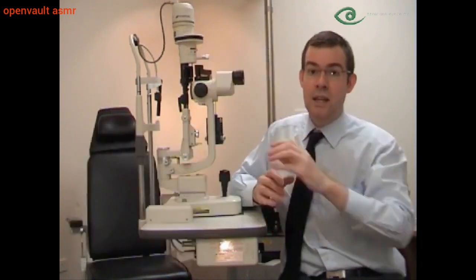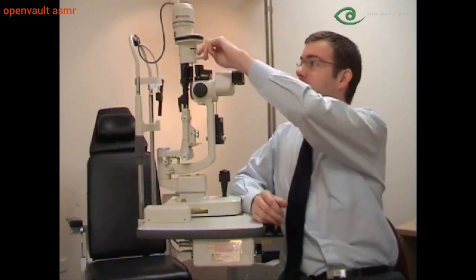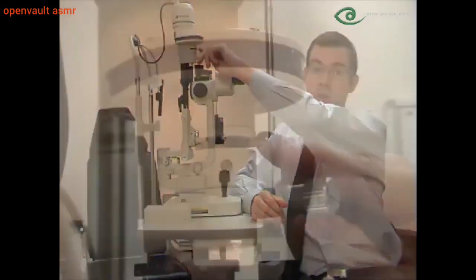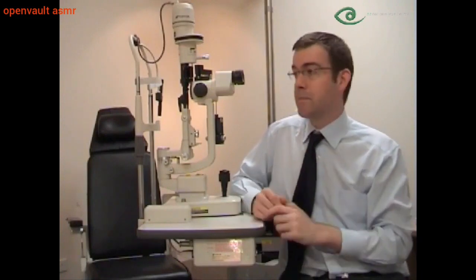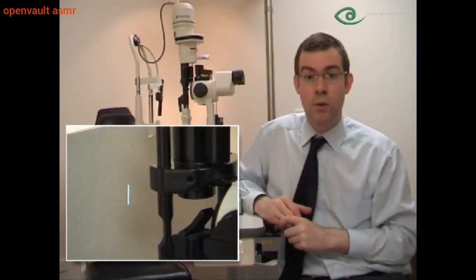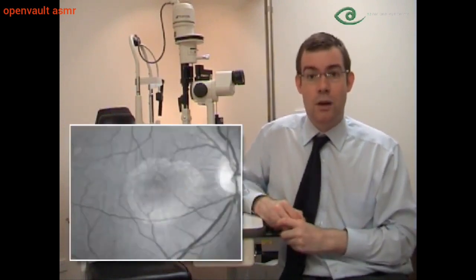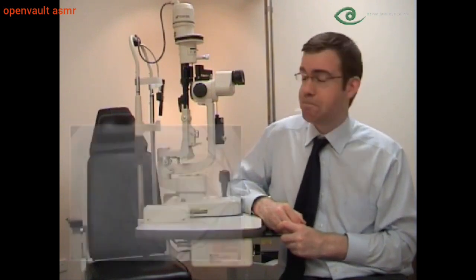This lever adjusts the number of filters, and we've got neutral density filters which influence the brightness of the light. In this position there is a full filter, half filter and no filter, giving you the brightest light. Moving the lever further to the right will give you a green or red free light. Under this light, objects which are red, such as blood vessels, will appear black, making them easier to visualize.